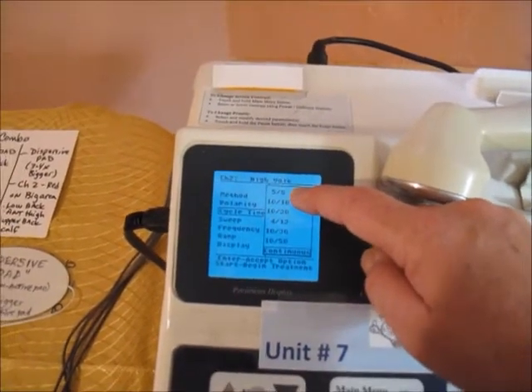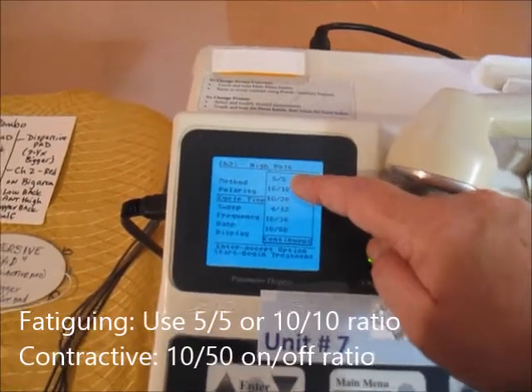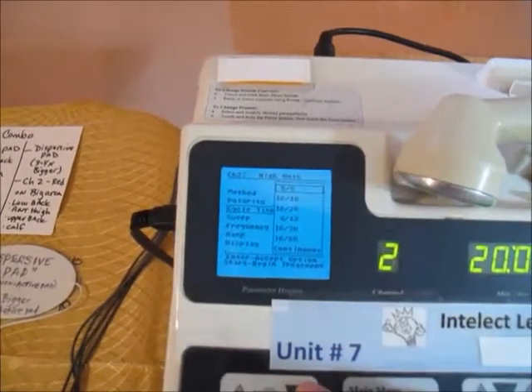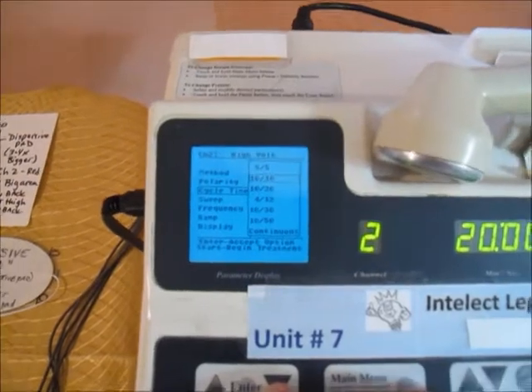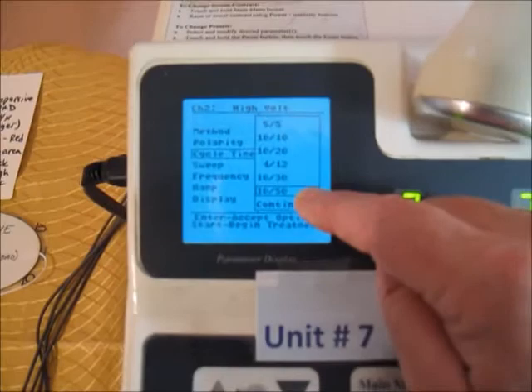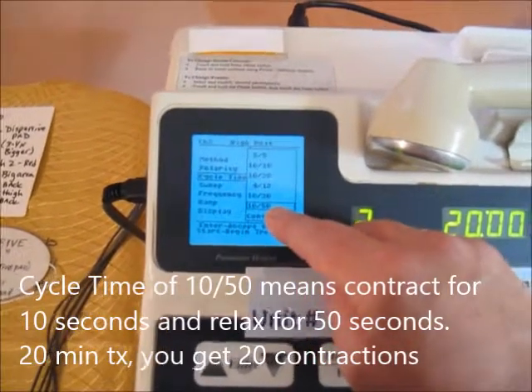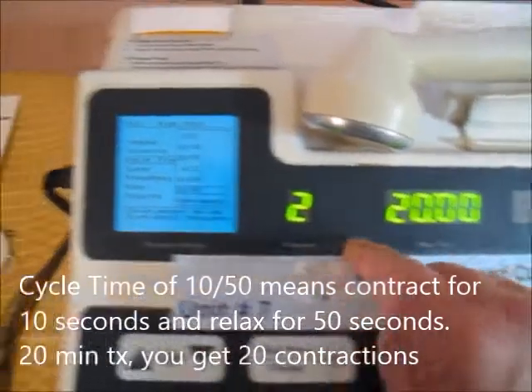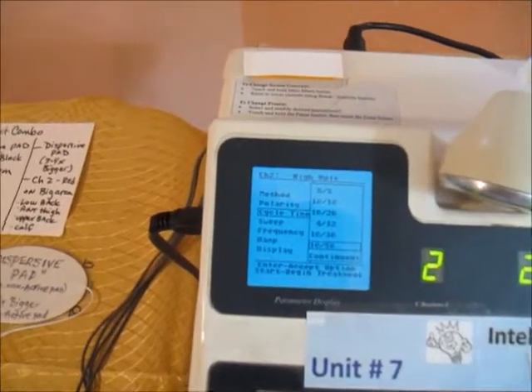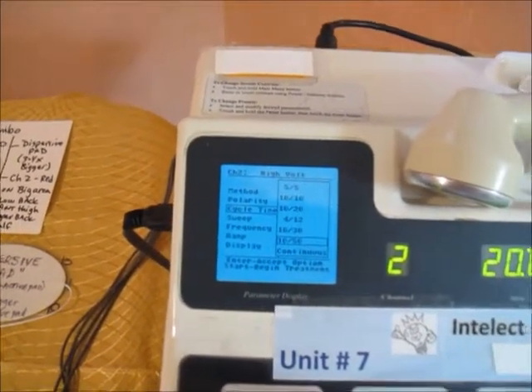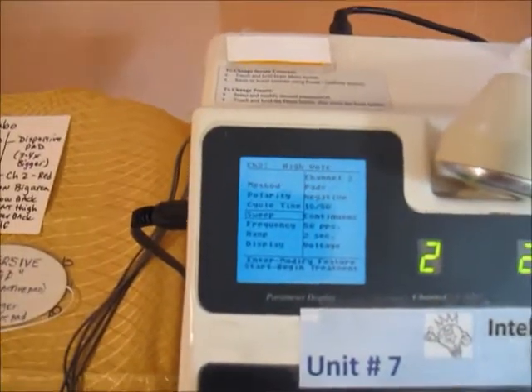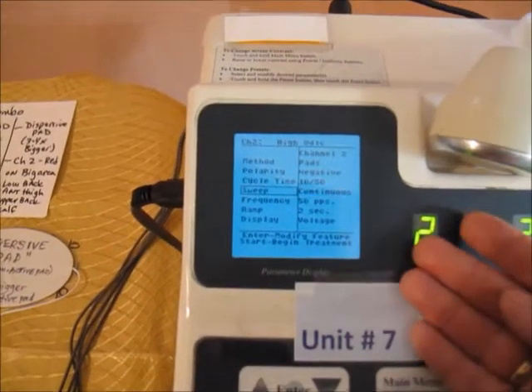The only cycle time ratios we'll use are a 5-to-5 ratio for fatiguing — or you could do 10 to 10. We don't have the ideal 5-to-1 ratio, so we use a 1-to-1 ratio. For contractive, we use 10 to 50, meaning you contract for 10 seconds and relax for 50. Over a 20-minute treatment, that gives you 20 contractions. Then we'll go back to the other screen and move on to sweep.